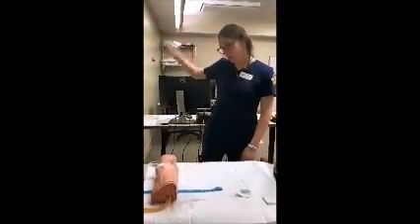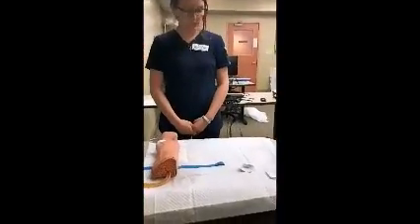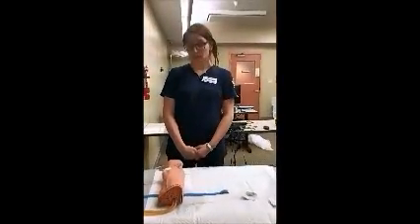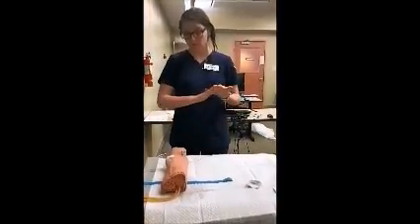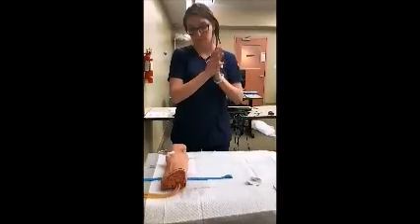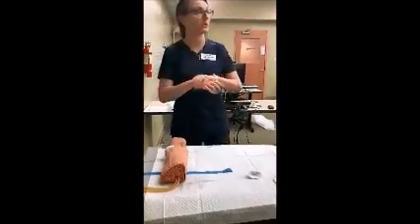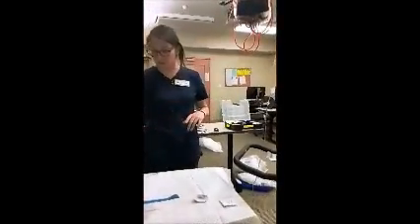Okay, knock knock. Hi Joe, how you doing? I'm good. How are you? Oh, I'm doing good. Hey, I just came in here to check your IV. Can you verify your name and birthday for me? Joe Schmo, 3/22/78. Okay, I performed some hand hygiene there. So I'm just going to check and make sure that everything's still running smoothly here with this infusion, okay?